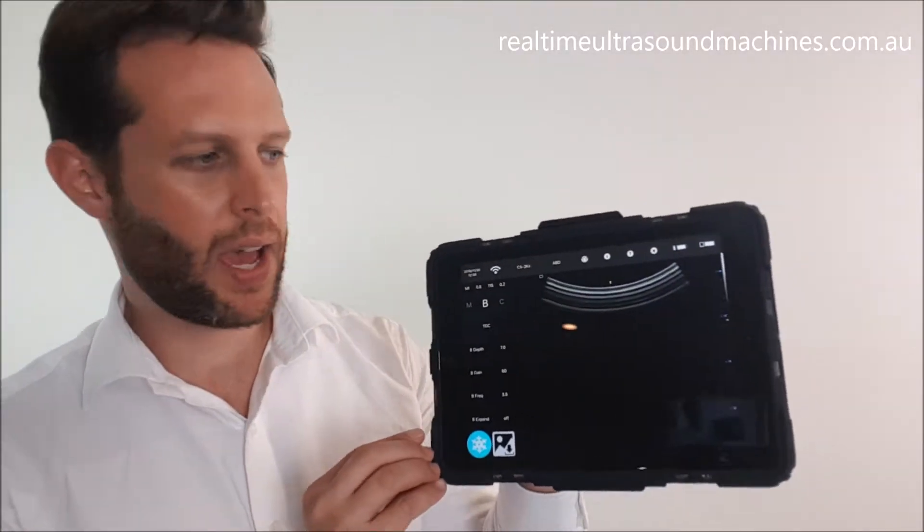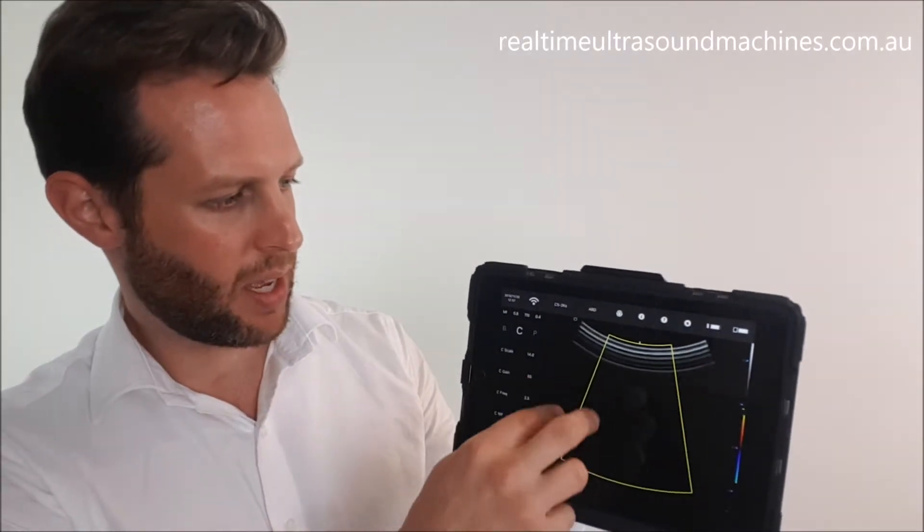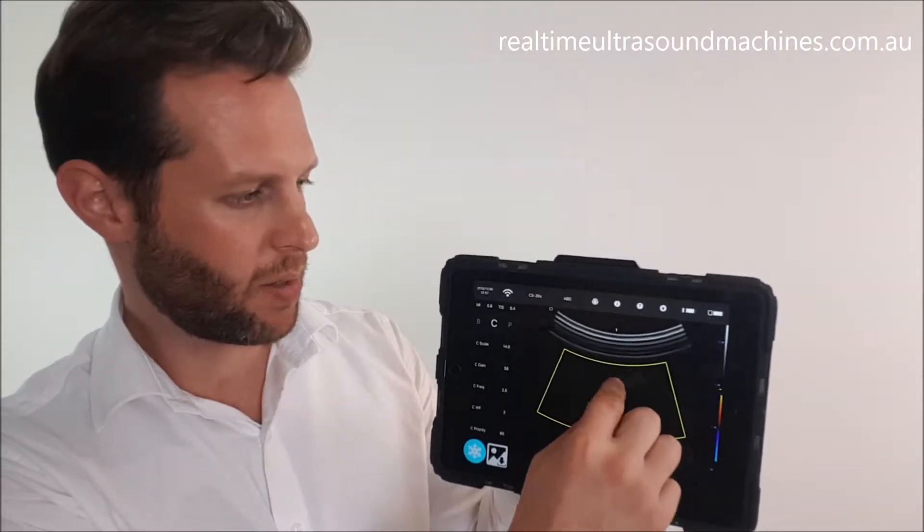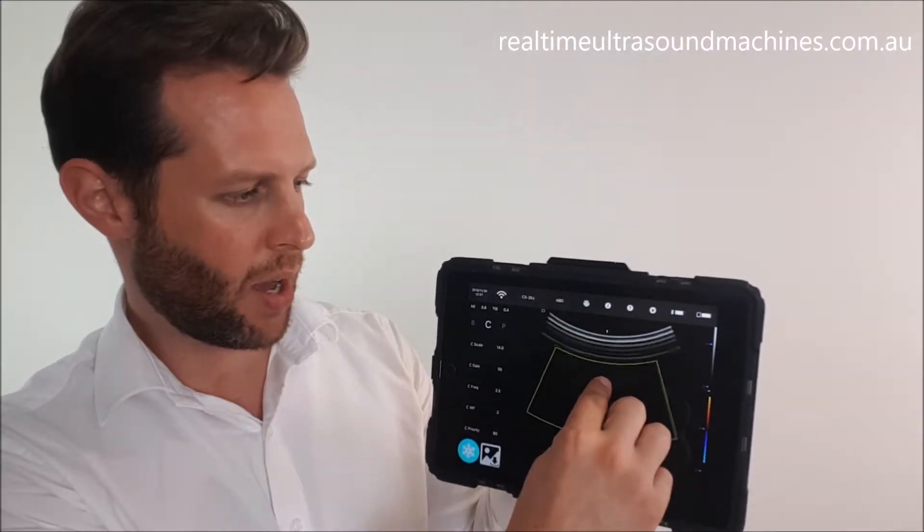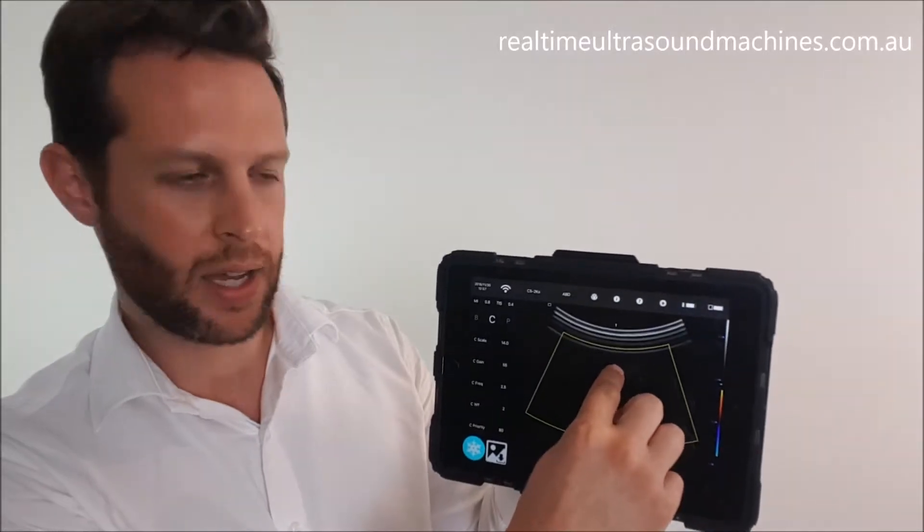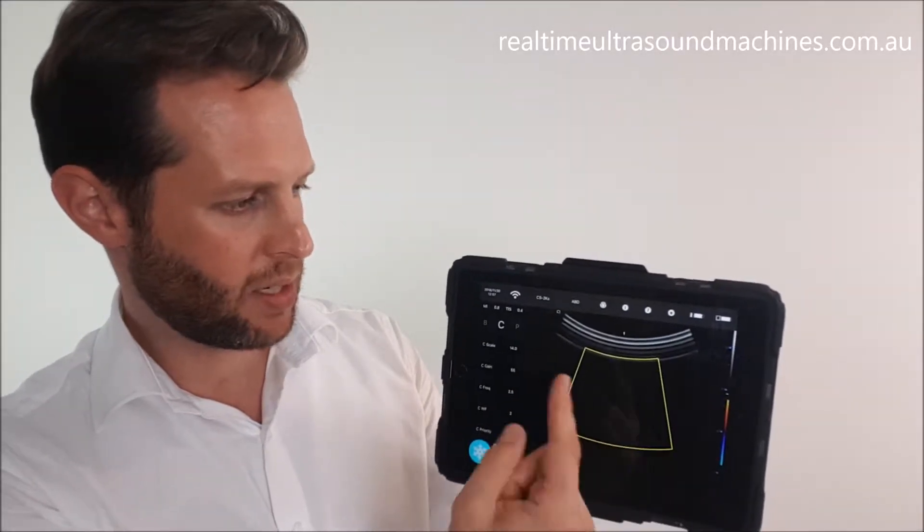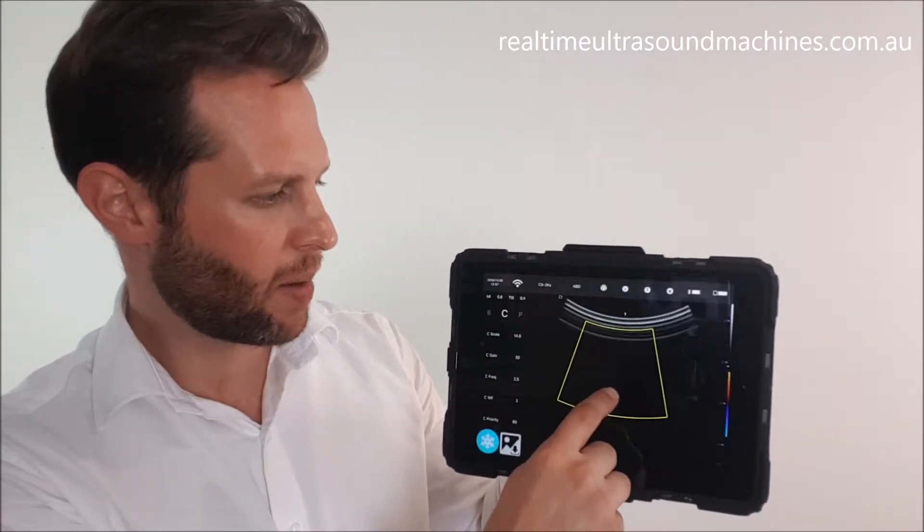If your unit has Color Doppler mode, you can access it by sliding across to the C. When you hit that, you'll bring up a little sampling box which will sample the color region. You can adjust the box by using your fingers to pinch and increase the depth or width, and using one finger you can change the position of that sampling box. You've also got Power Doppler (the P) and Pulse Wave Doppler.